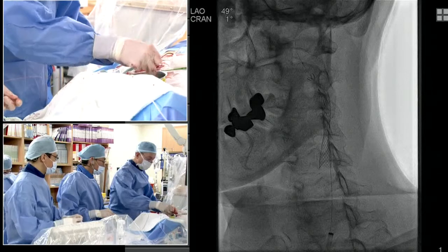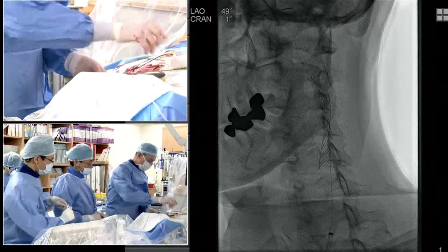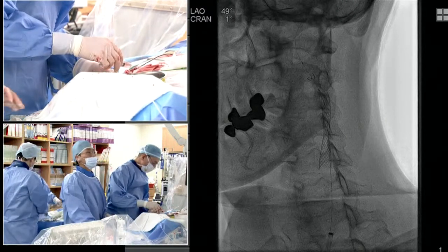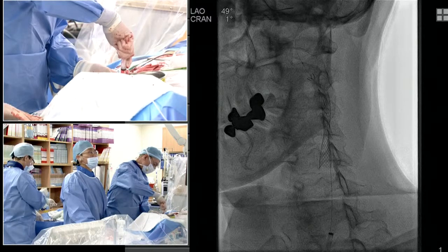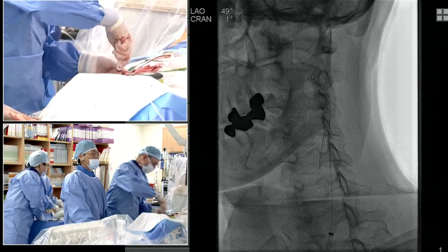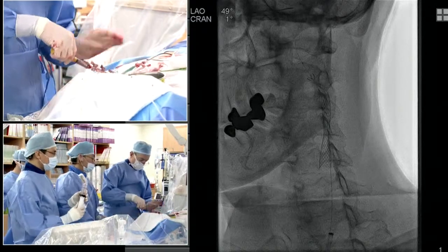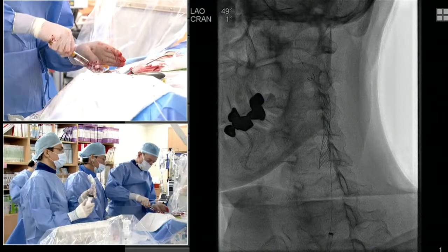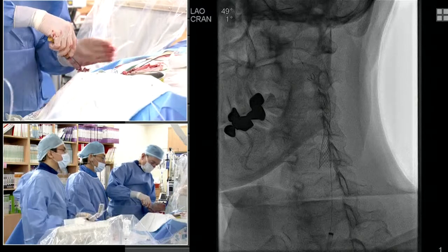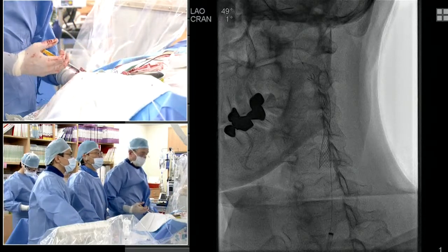Now, Gore has a new stent out, the scaffold, which has a mesh around the nitinol portion, presumably to reduce the risk of distal embolization. Any thoughts, Mark, regarding that, or from the panel, whether that's needed? I think to some degree it depends on the lesion. So certainly the more unstable the lesion, the more likely it is to have unstable plaque or thrombus, the more I'd like to have something just like that.